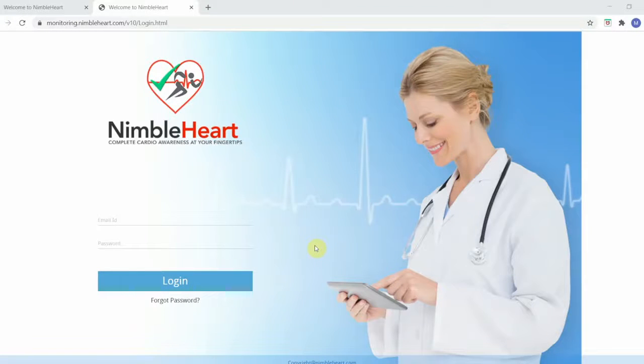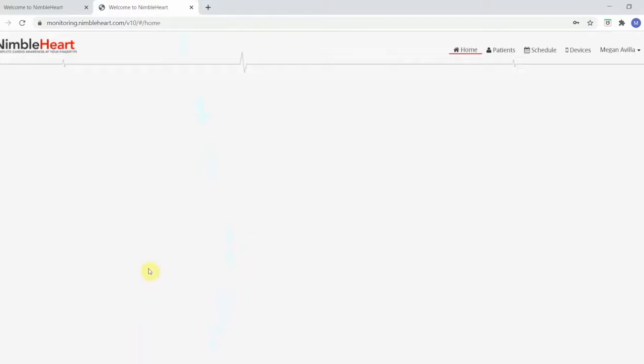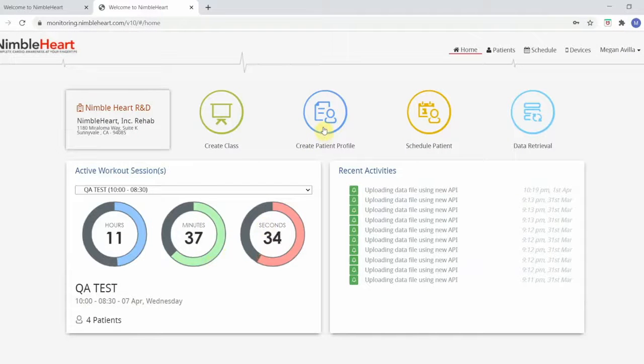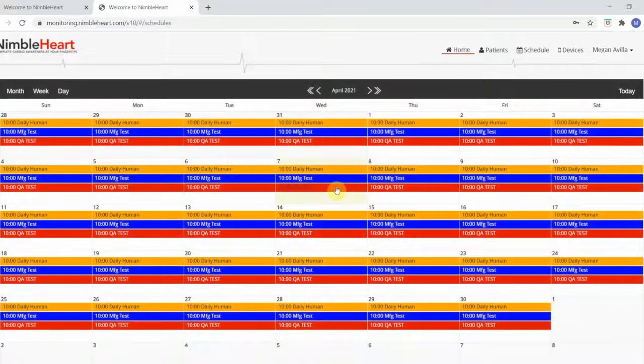Offering home or hybrid rehab with telemetry to multiple patients is easy. Log on to the NimbleHeart portal. Create a class. Create a patient profile. Schedule the patient into your class.